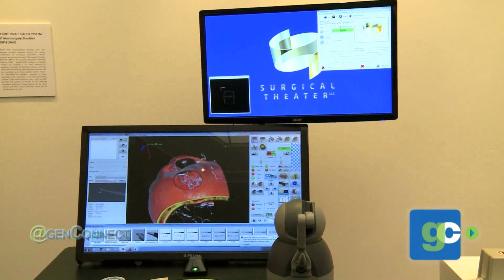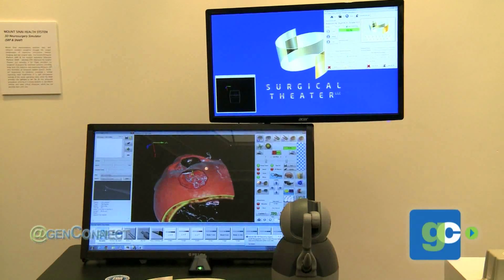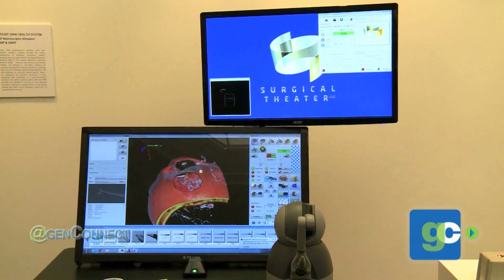What's the most incredible part of using this sort of simulator? What's most incredible about this actual technology? I think what's the most incredible is that you can simulate the actual brain surgery itself based on the patient's own anatomy. It takes the information from a high-resolution CT scan or MRI of the patient, and it allows the surgeon to manipulate in a three-dimensional manner all the different structures and make them aware of all the potential obstacles, maybe blood vessels that they may have to deal with prior to cutting open the patient. So fewer surprises. Fewer surprises.